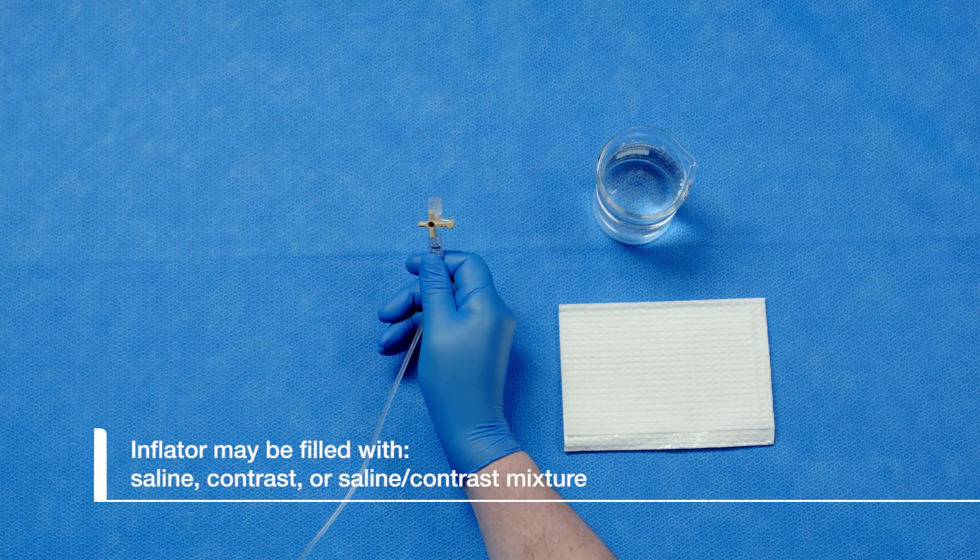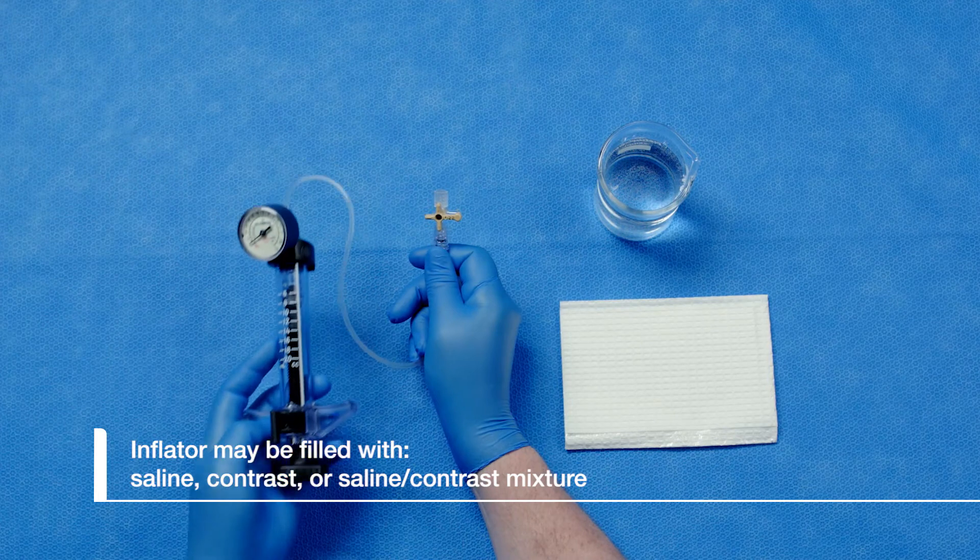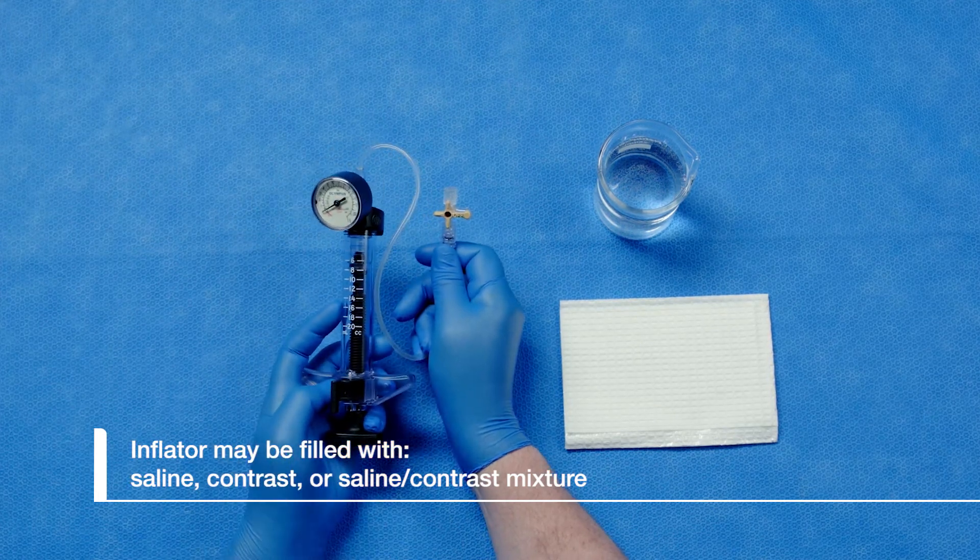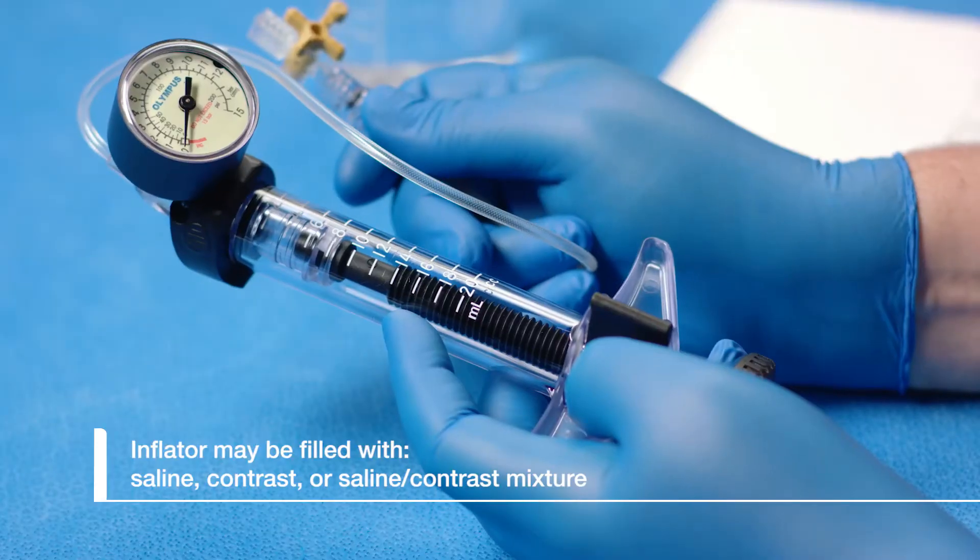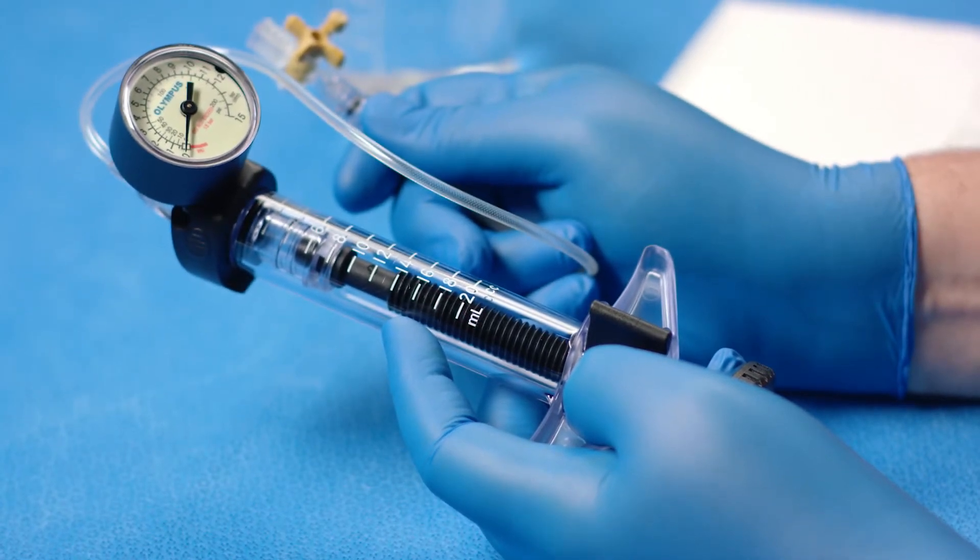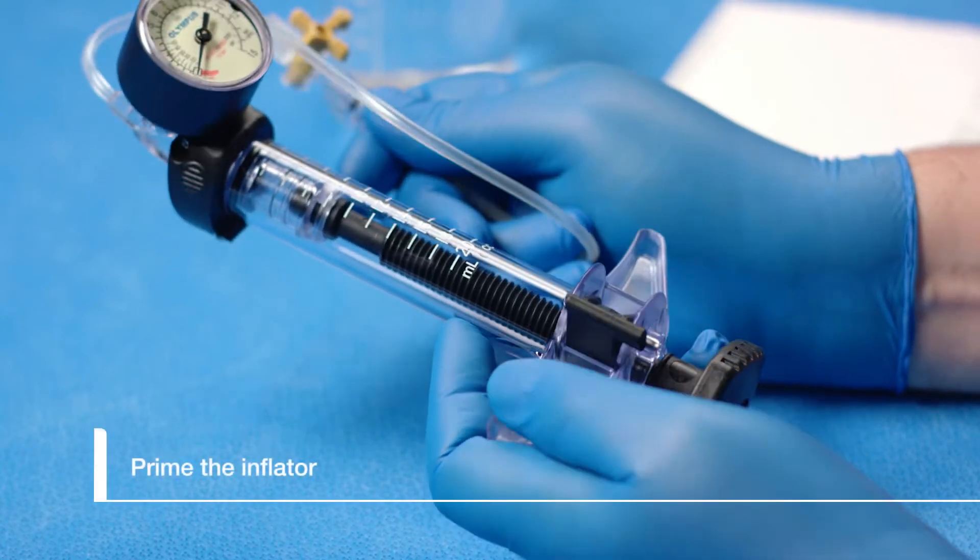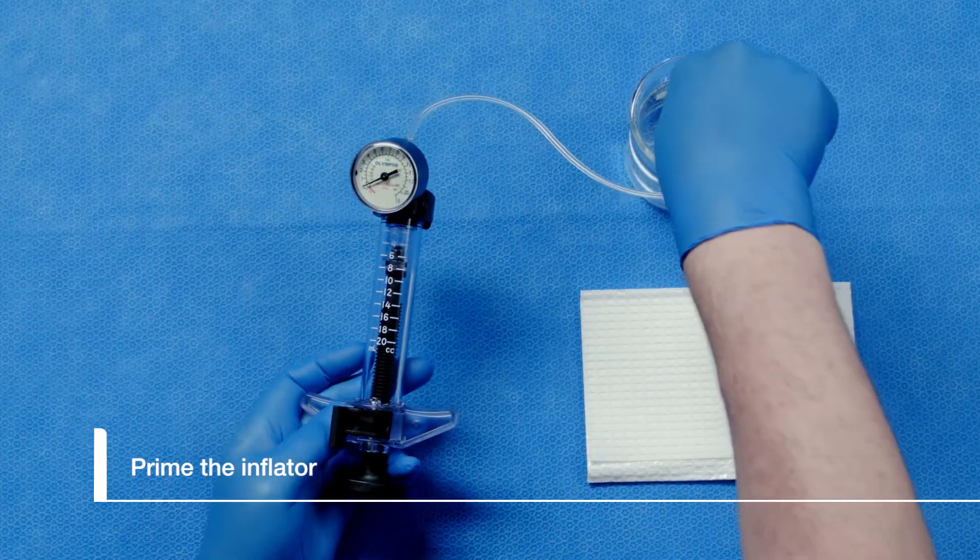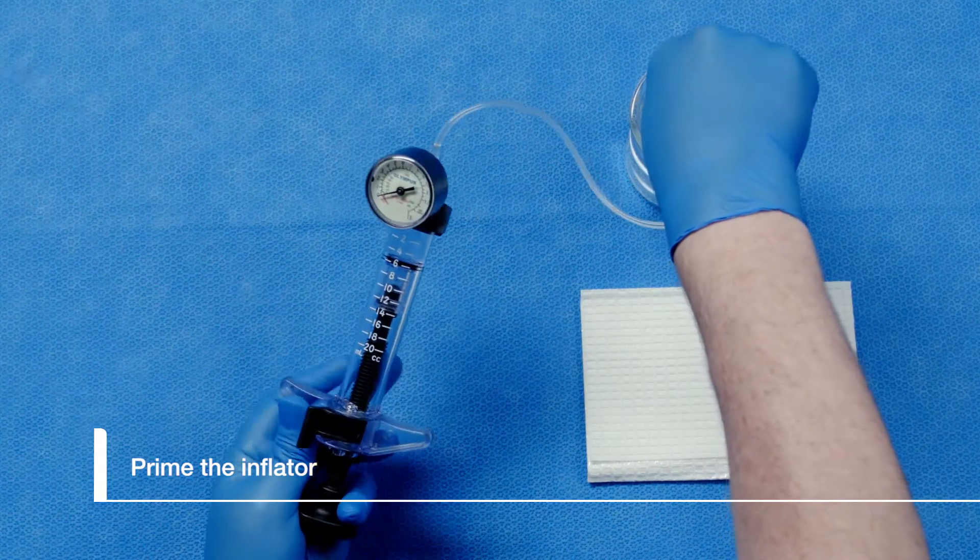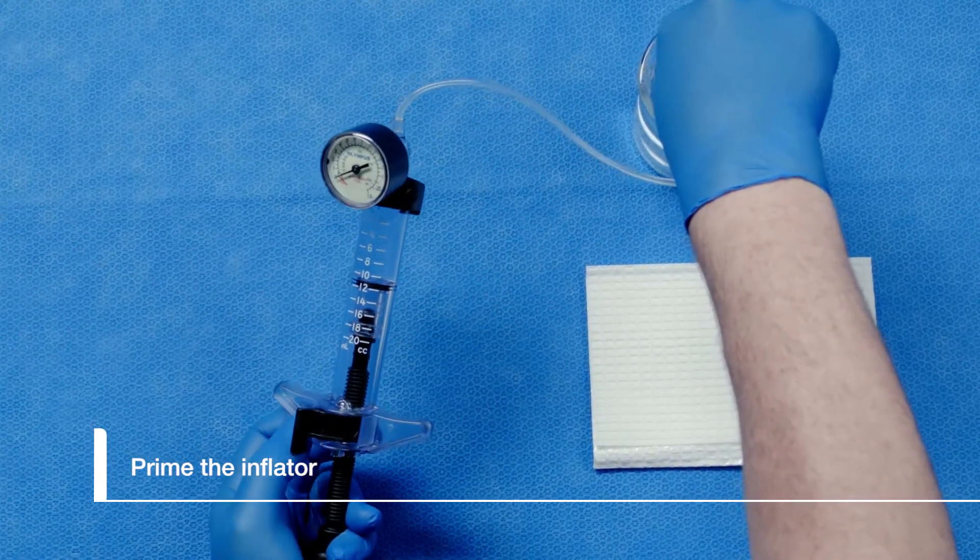The inflator can be filled with normal saline, contrast, or a mixture of saline and contrast. The inflator packaging can be used as a basin for the fluid. A syringe filled with fluid may also be attached to the T-piece. Ensure the locking switch on the inflator is in the left position and draw back the plunger until the inflator is filled with 12 milliliters of fluid.